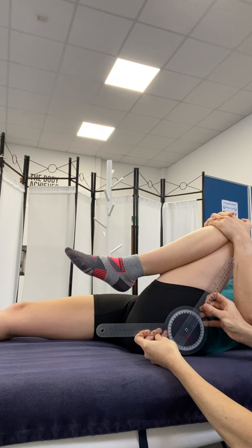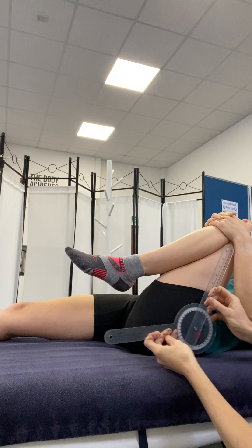And here we have 125 degrees hip flexion with knee flexion. Now we do this on the opposite side too.